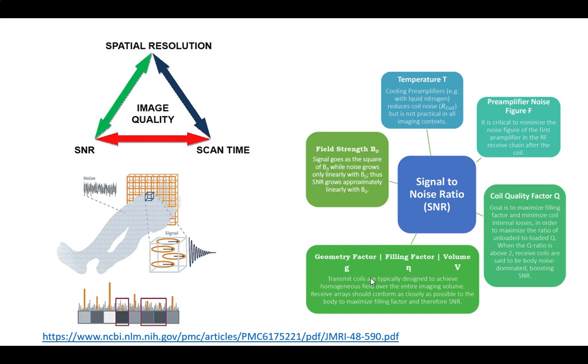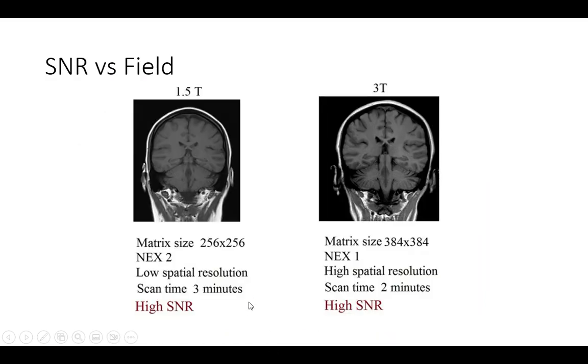And this is kind of part of the statement, but the canary in the coal mine, if you're familiar, miners would take canaries in because their smaller bodies would get killed off first. Well, the smaller bodies of animals can't handle the heat, so they'll be much more sensitive than you will. The link on the bottom here is the article that has most of this stuff in it that I've been mentioning. That is free.